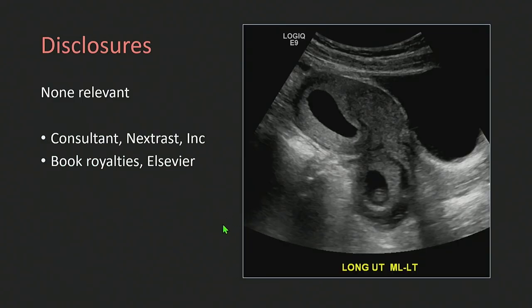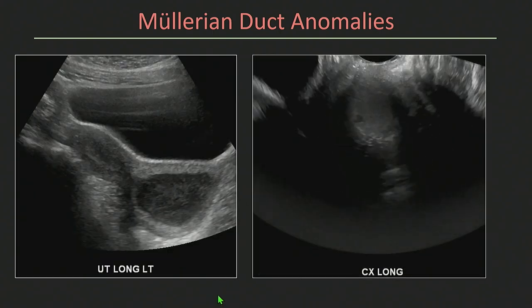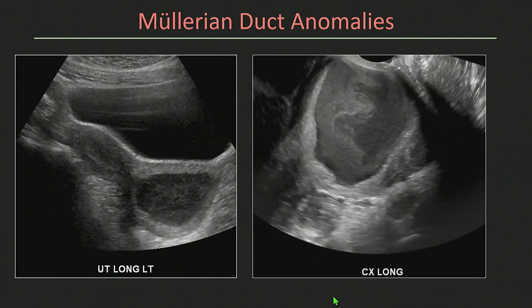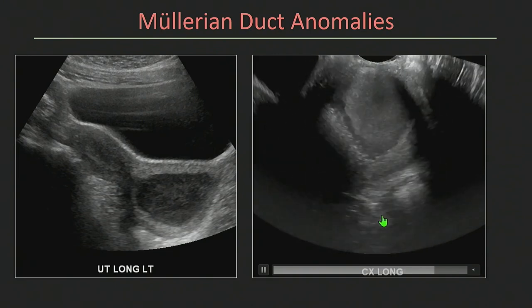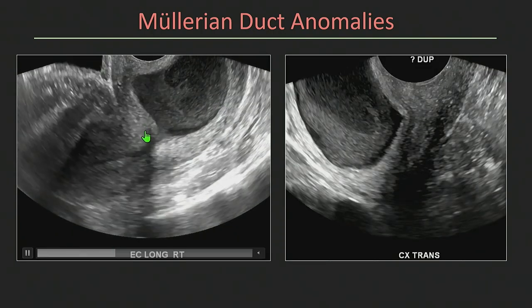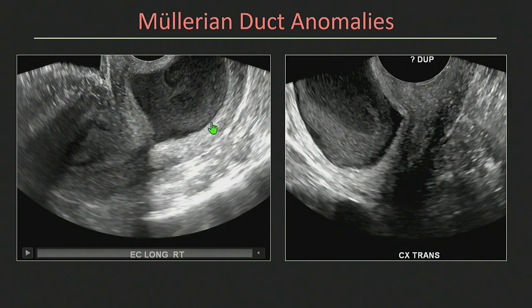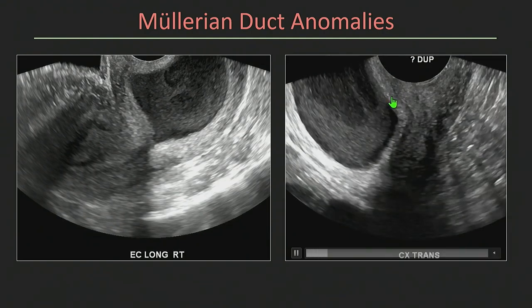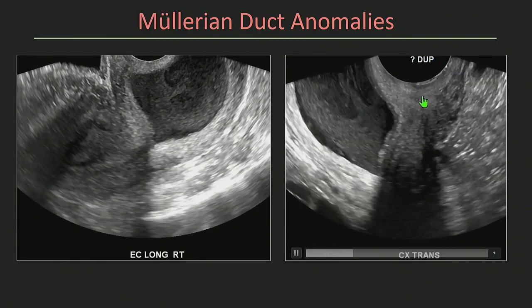These are my disclosures. Let's start with a case. This is a 30-year-old female with green vaginal discharge, no prior imaging. Here's a sagittal transabdominal longitudinal image of her uterus. You can see there's an abnormality towards the cervix. Here's the corresponding endovaginal imaging showing a large heterogeneous fluid collection in the region of the cervix and vagina. It looks like basically a big clot. You can see there's probably some retractile clot or heterogeneity of the blood products within the collection. On the transverse view, the sonographer noted there may be some sort of duplication, possibly a Mullerian anomaly.